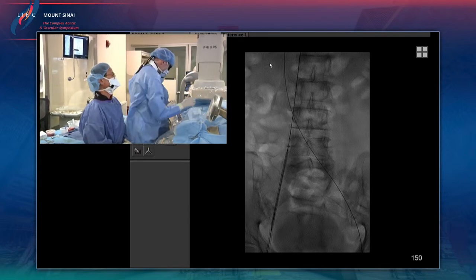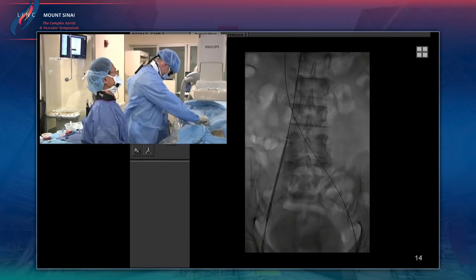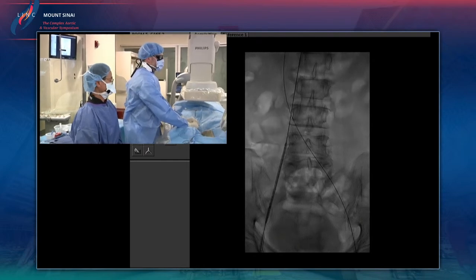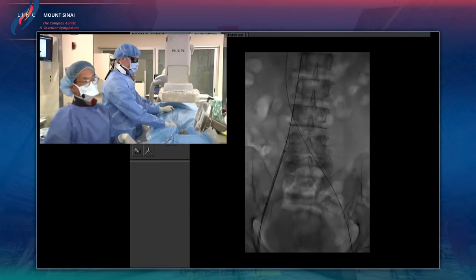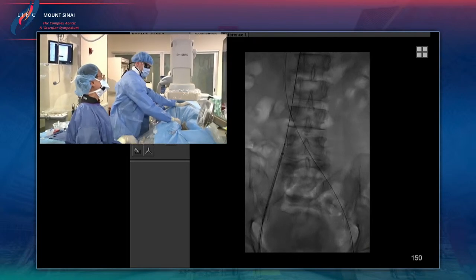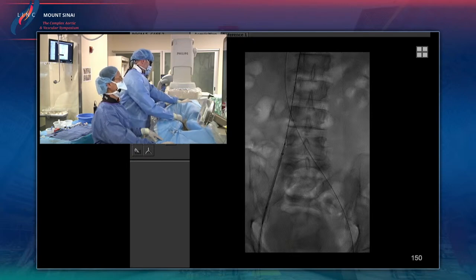Aki, are you using IVUS routinely for all of your deep vein non-thrombotic cases? Absolutely. IVUS has obviously the diagnostic aspect of it, but also in terms of determining where to land a stent, where the proximal part of it should end up, and where the distal part should end up. The patient's moving a little bit. That you're going from open to open. These are things that IVUS can help with tremendously, just technically speaking.